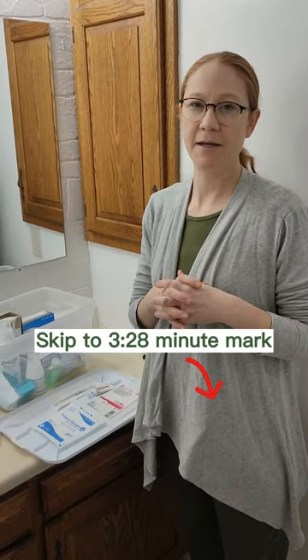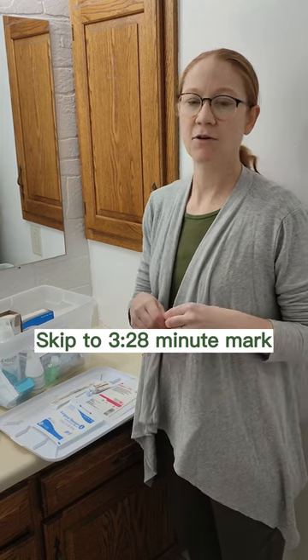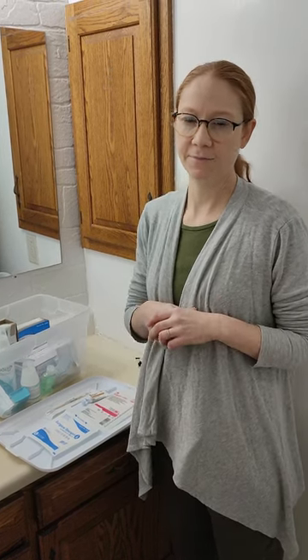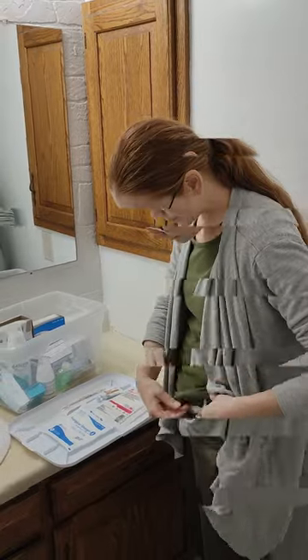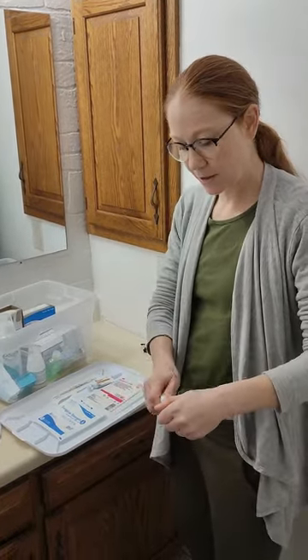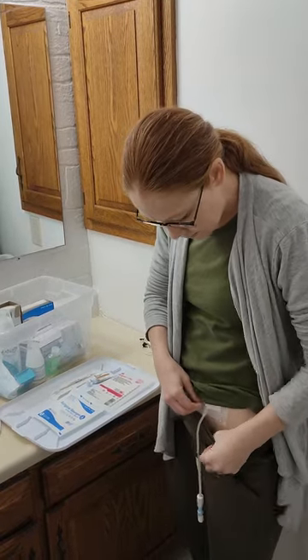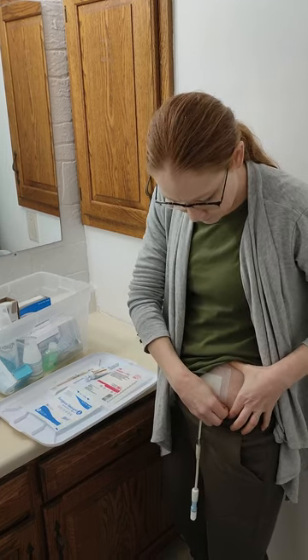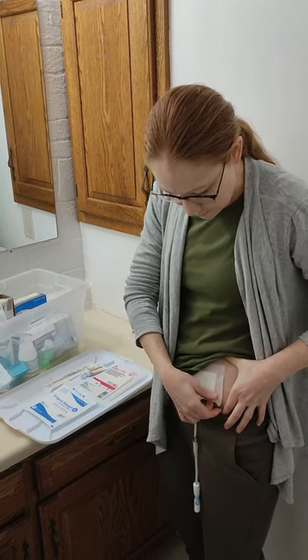Warning for the next part — I'm gonna actually show my PD catheter site, so if that's something you don't want to see just skip the rest of this video. So here's the catheter, here's the end tip, this is where you hook up. I have a bandage on there and I've already soaked my stuff here, so I'm gonna pull this off.